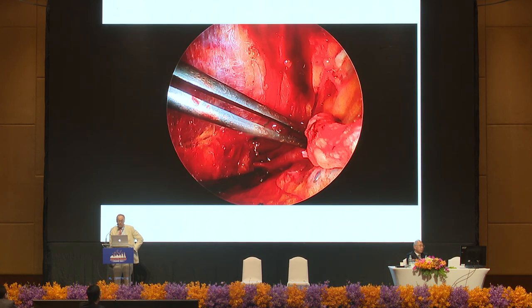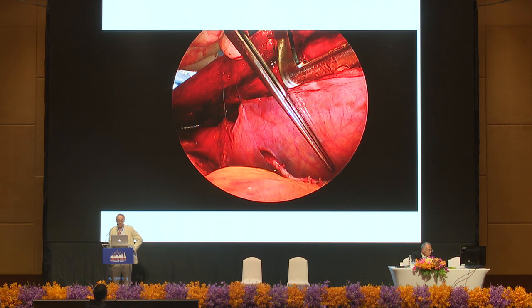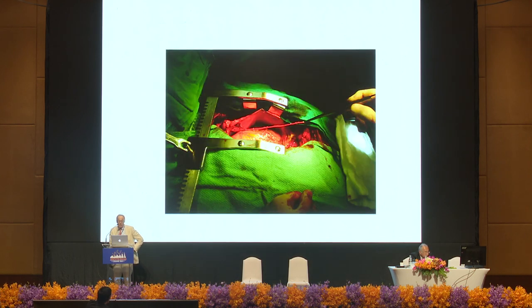Up high, that's the pericardiophrenic branch. That doesn't seem to have any issues with the diaphragm if it's divided. And of course, we go right up to the top and divide that large first intercostal branch. Make the tunnel through the mediastinum extrapleurally and bring it through a fenestration of the pericardium. And there it sits. And of course, you see you get a very beautiful long conduit.